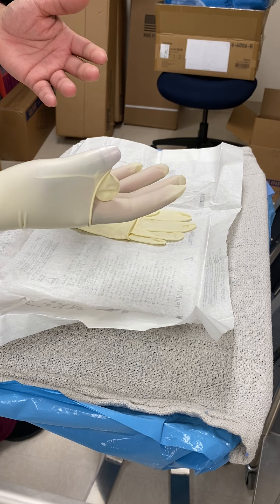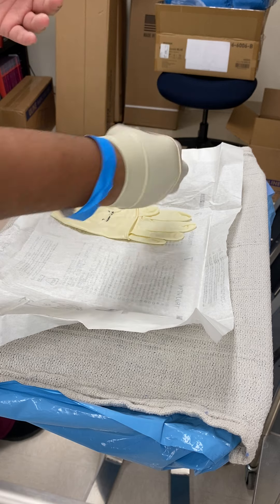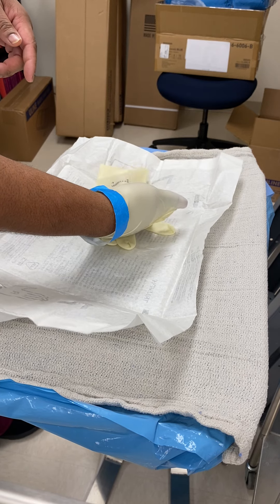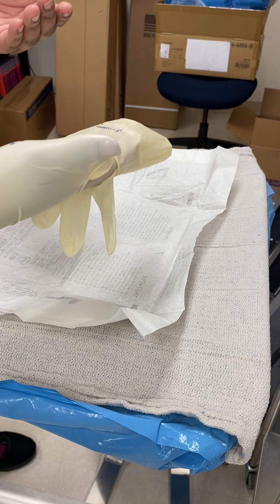Now the next thing you're going to do is slide your fingertips into the folded cuff of the left glove. What they mean is this part right here is that folded part, and all you're doing is sliding your hands in so that you have something kind of like this.